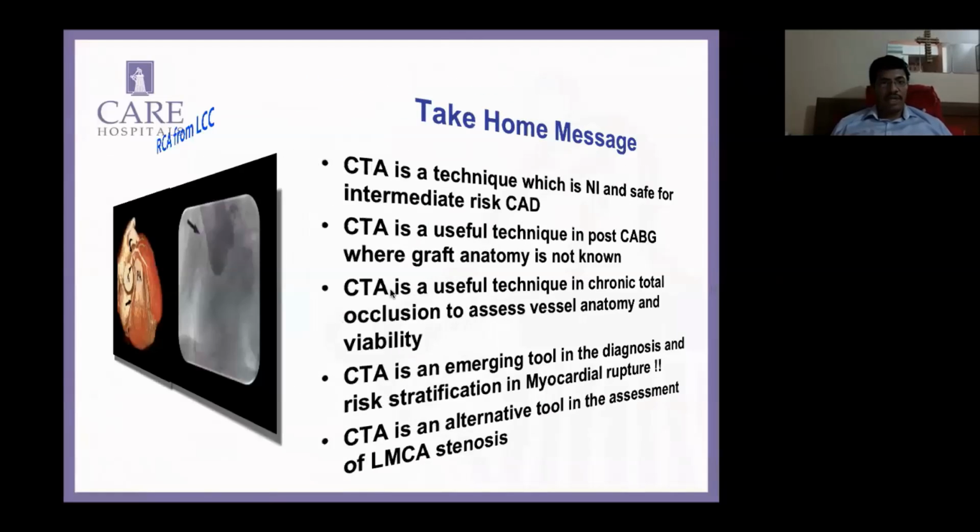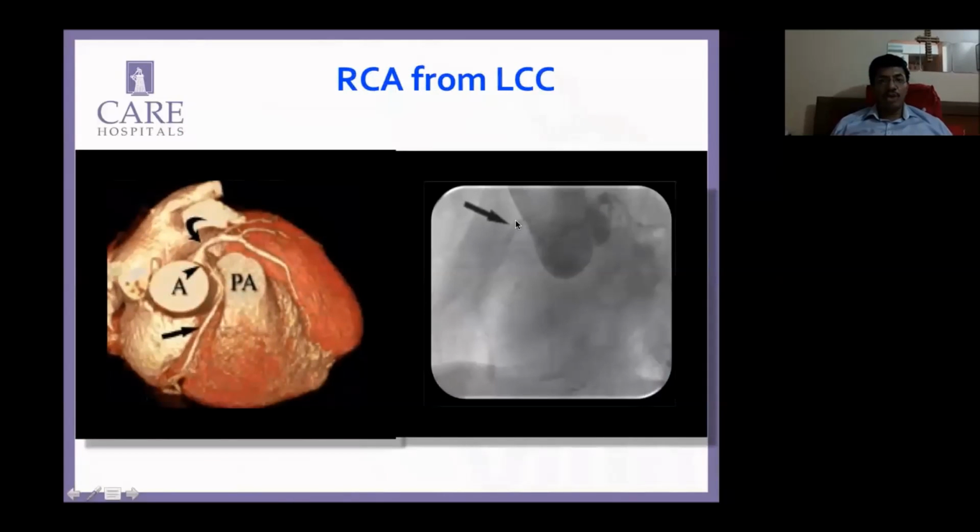The other thing I would like to say in response to what Sharat said, and I think that is relevant, is that even if you were able to hook this anomalous artery, you would still end up doing a CT. The reason is that although you would see the course, you would never be able to tell whether it is actually between both the great arteries or anterior or posterior to anyone. So I think CT is one of those definitive indications when you're suspecting an anomalous vessel. Even if you do cannulate them and get the origin clear, you would not know whether it's an interarterial course or not.